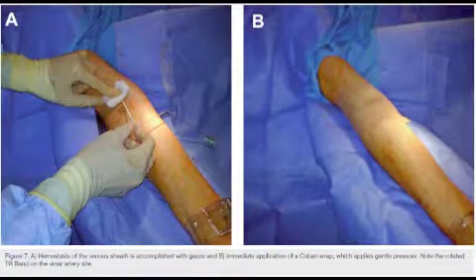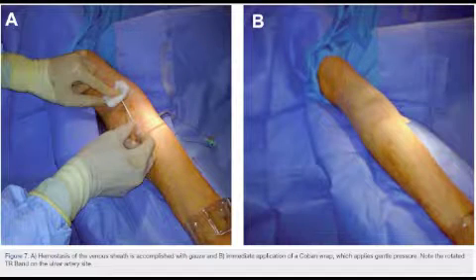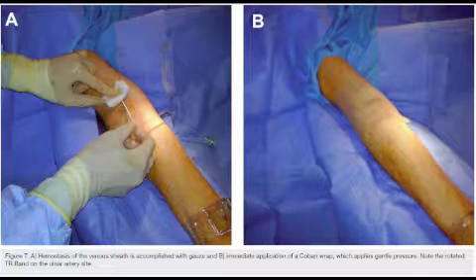The way the physician found your pulse in your wrist would be the same way that the physician would locate the brachial artery in your upper arm. This would be the access for the physician to be able to complete the procedure. This is the third and final access point, the brachial artery. It is least commonly used among physicians. The procedure, however, is performed the same as the radial and the femoral.